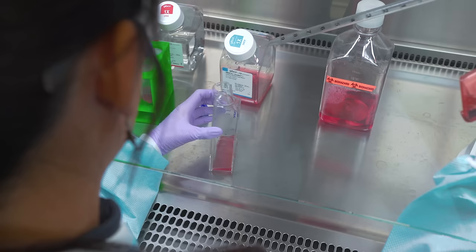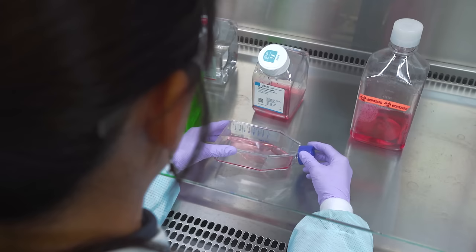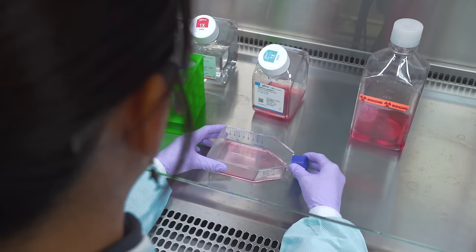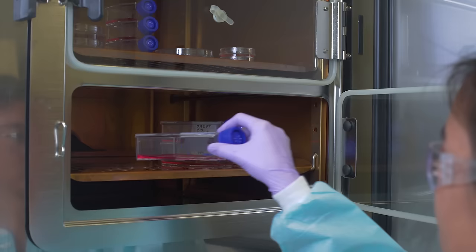Cap the vented caps on your flask tightly. If the caps are not vented, cap loosely. This keeps contamination out while allowing adequate gas exchange. Use a north-south-east-west motion to evenly distribute the cells and transport the flasks to the incubator.